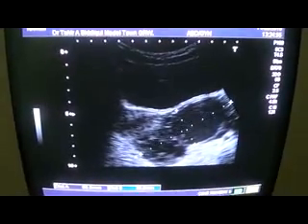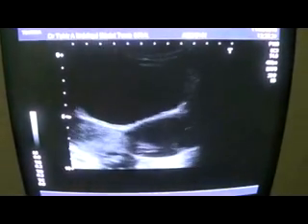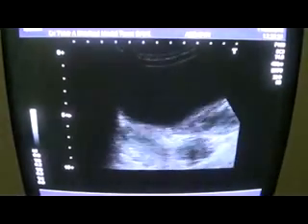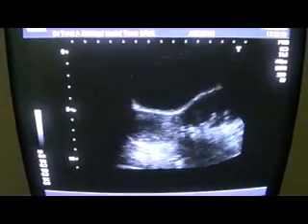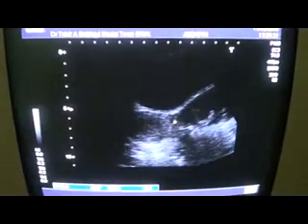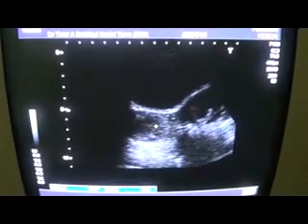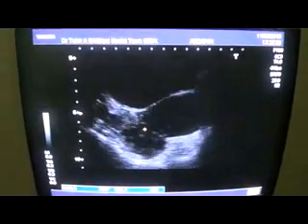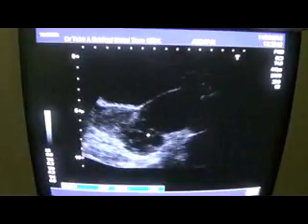8.6 into 3.5 centimeter in total, and this is in the region of the left adnexa. As you see, this is the uterus in transverse section. This is the endometrial canal. The uterus is unremarkable.